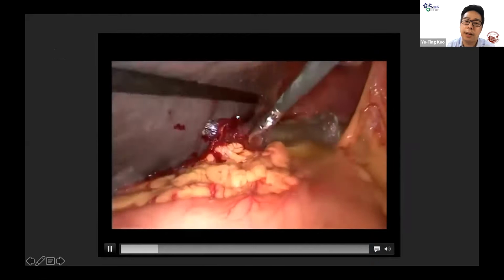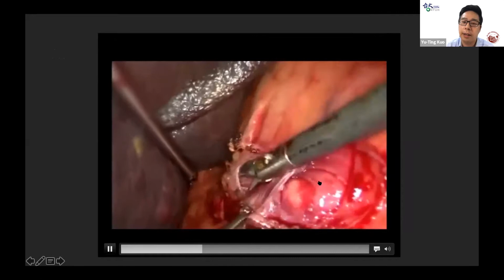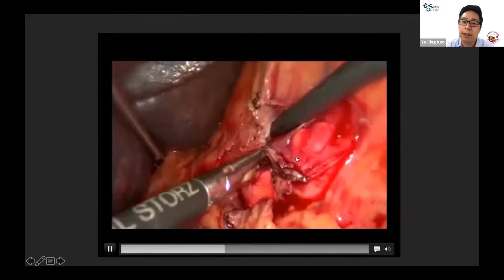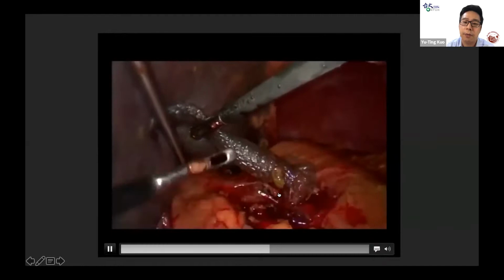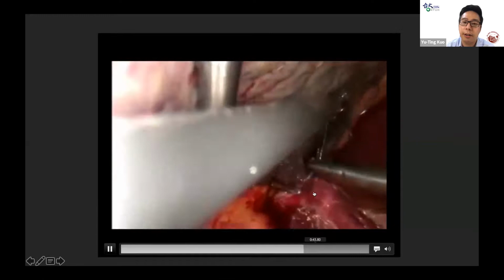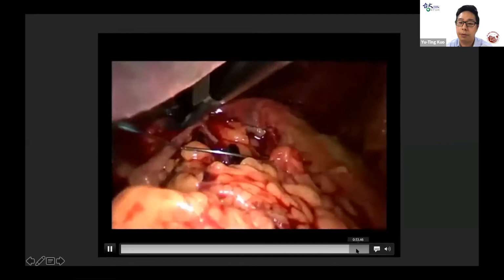Our friends, the surgeons, tried to find our puncture route. And at that time, I was also in the operation room, I used the endoscope to try to find the route, and I used alligator forceps. He helped me to catch this stent and put it inside the original hole. And finally, the patient was fixed with a needle to fix this stent. And actually, I think the patient is quite good up to now. The stent still has a good function.